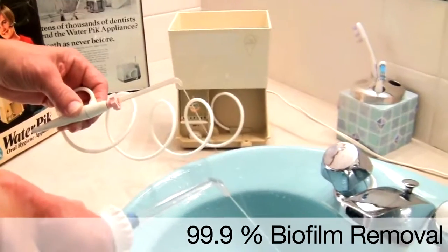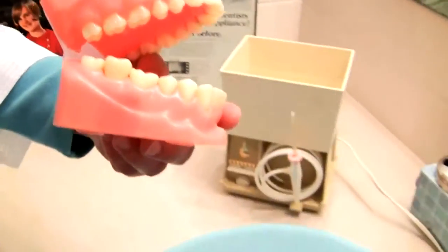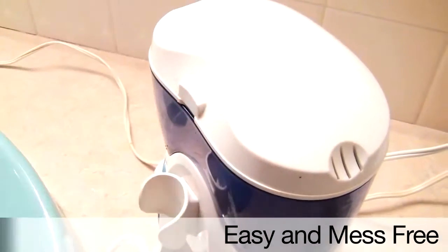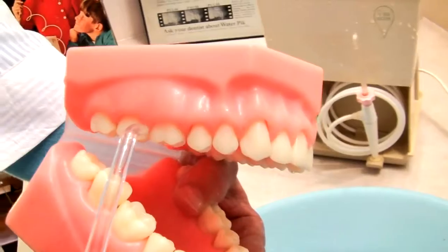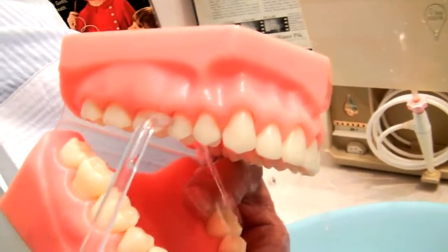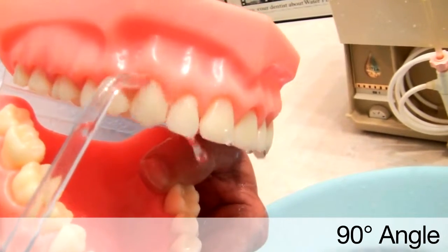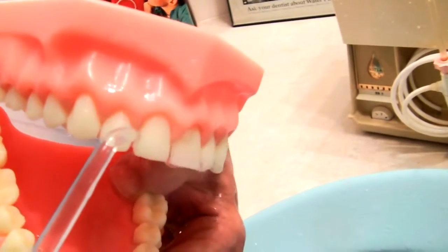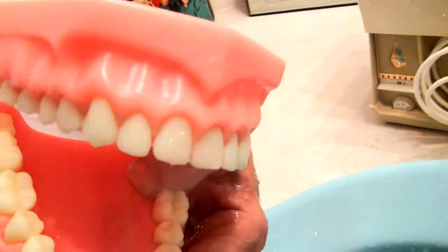Now is the time to discover the Waterpik for yourself. Keeping a few tips in mind, you will find it is easy and mess-free to clean your teeth and gums with the Waterpik. Here is an outside view demonstrating the angle of the tip to the teeth and gum tissue. A straight on, 90 degree angle is all that is required. Just remember, you want the water to shoot along the gum line and straight through the space in between the teeth.